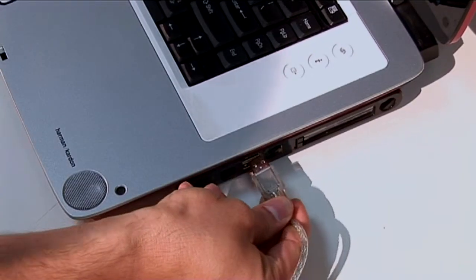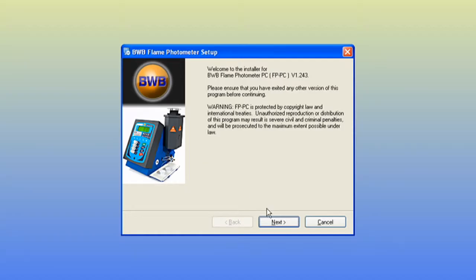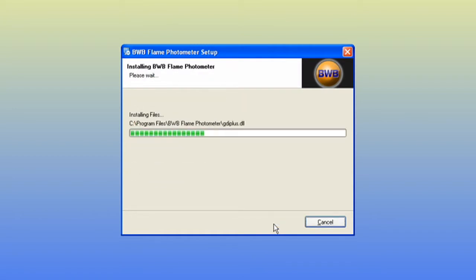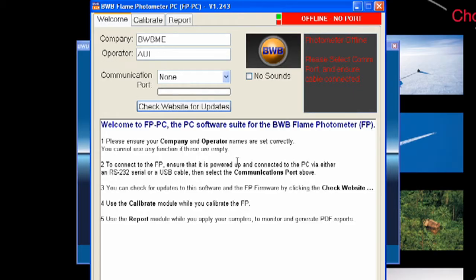Attach either a USB or RS232 cable to both the BWB and your computer. Now follow the on-screen instructions to choose the installation destination. Open the application to bring up the welcome tab. Enter your company and operator details.